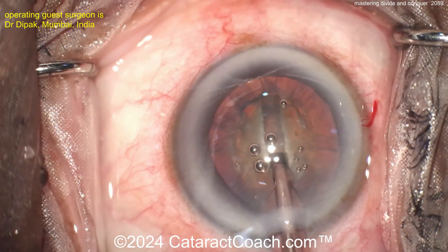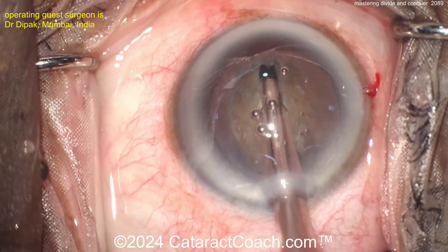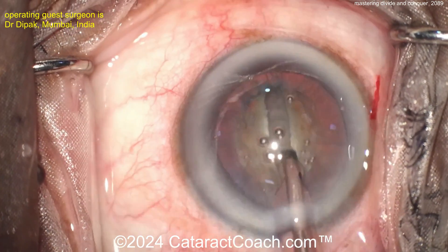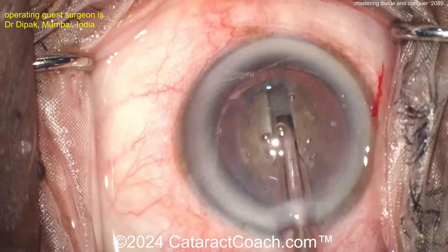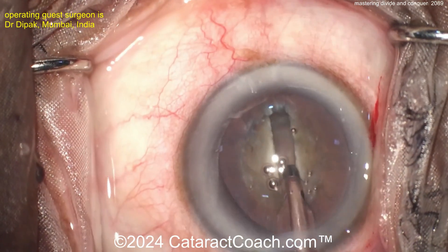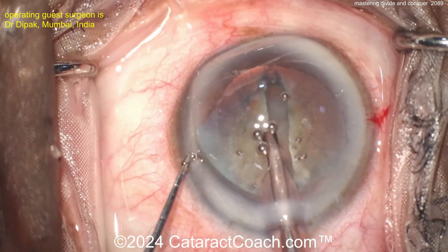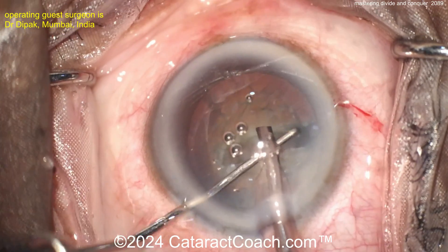In a case like this, using a power of about 20 to 40 percent ought to do it — it's not too dense of a cataract. Nice looking grooves here. Remember, the grooves are deeper in the center and shallower towards the periphery. Look how the eye stays in primary position as the groove is being done — the surgeon is doing a great job. If you're a young surgeon and the eye keeps moving towards the nasal canthus, that's not good.